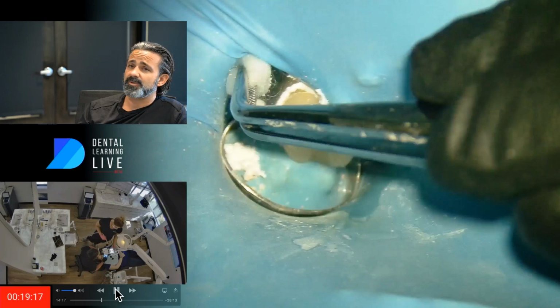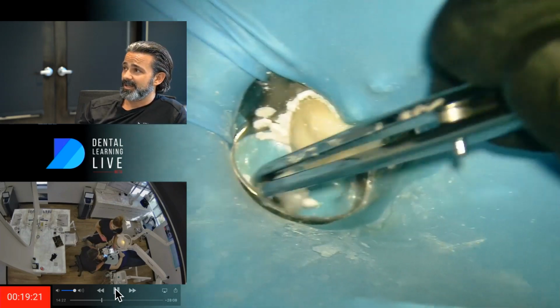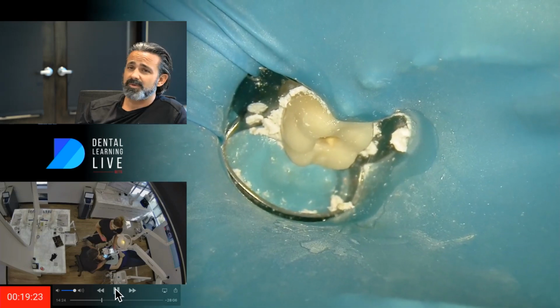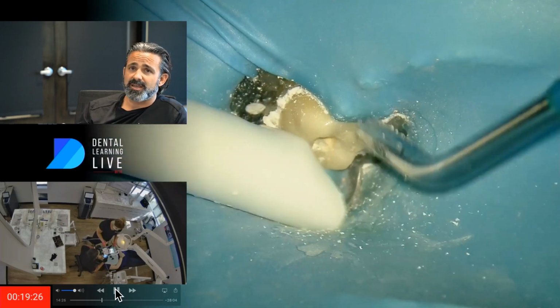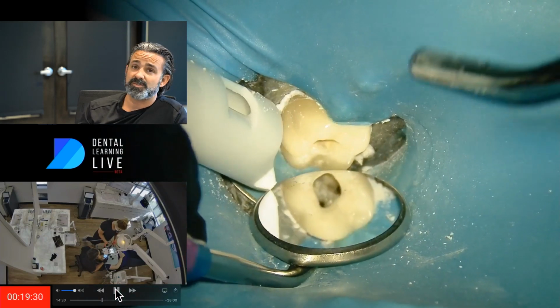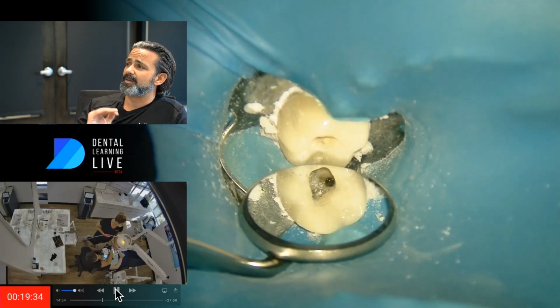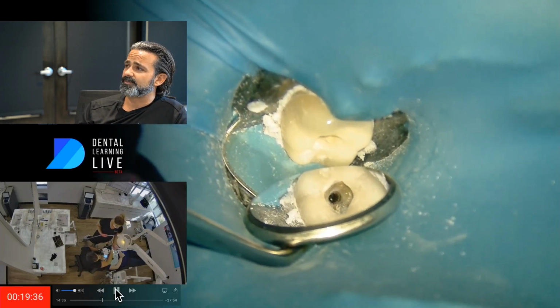And so what I'm doing on this crown is I'm just taking alcohol on a gauze and I'm just scrubbing it clean. I'm scrubbing the rubber dam. I've used a lot of chemicals up to this point. We used isopropyl, we used C-form, we used hypochlorite, and I'm also trying to remove any pellicle that may be on the tooth structure.